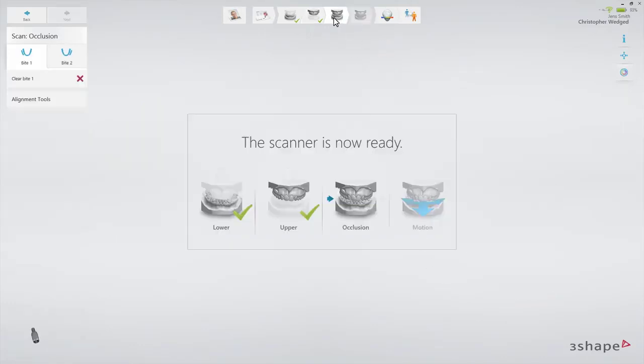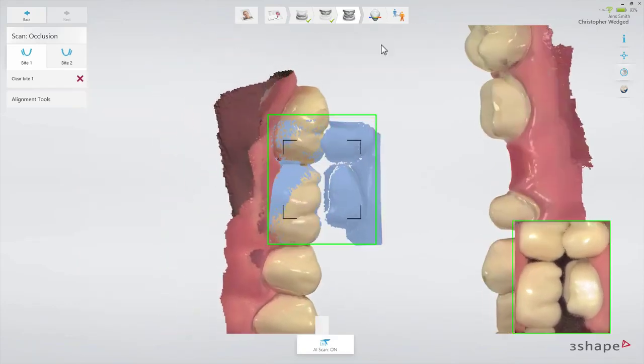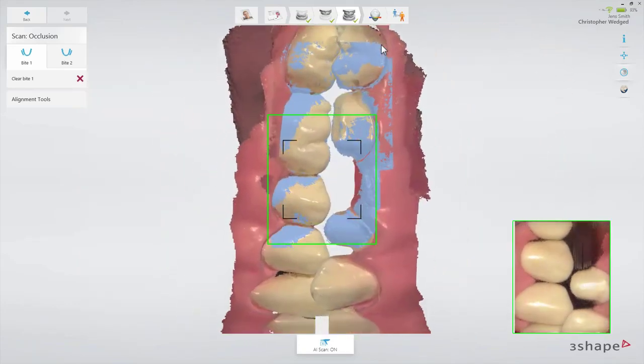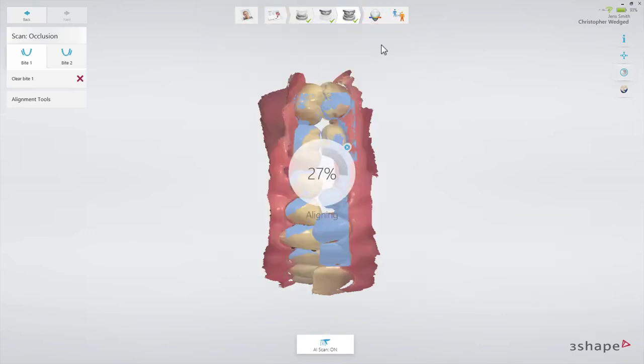page. Insert the scan tip to the second molar on the buccal side. Ask the patient to bite. Scan 3 or 4 teeth until the upper and lower arches snap to the bite scan. The light blue surface indicates the surface covered by the bite scan.